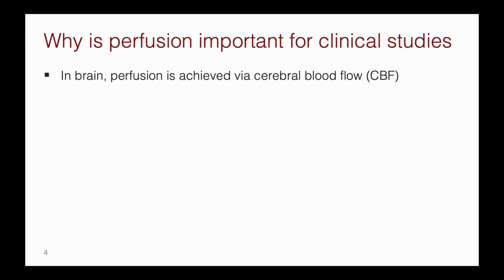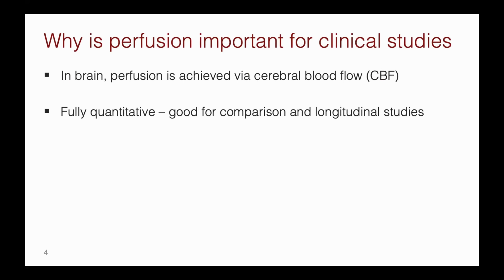I would like to begin my talk by highlighting why perfusion is important to study. First of all, when we talk about perfusion in the brain, we often call it cerebral blood flow or CBF. But I think it is somehow a bit unhelpful as we are not measuring flow per se, but we are actually measuring delivery instead. But because CBF and perfusion are often used together in the literature, I will consider them the same in my presentation. And also perfusion is a good metric for making comparisons between groups such as patients and controls.